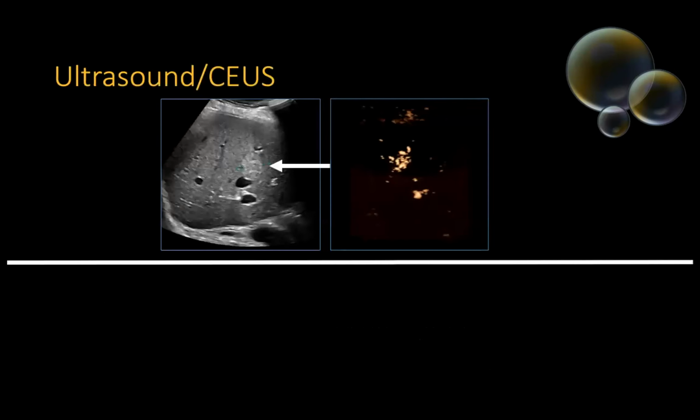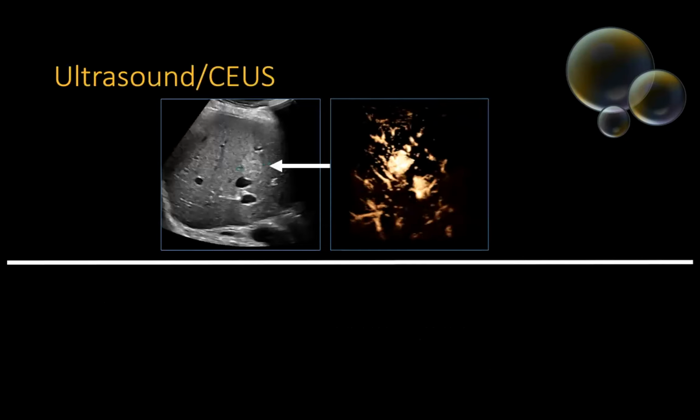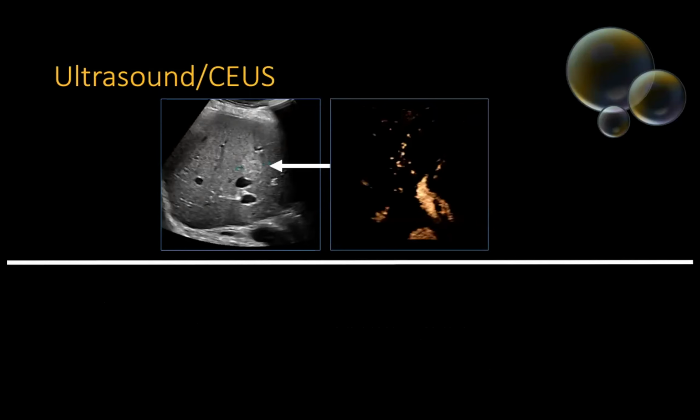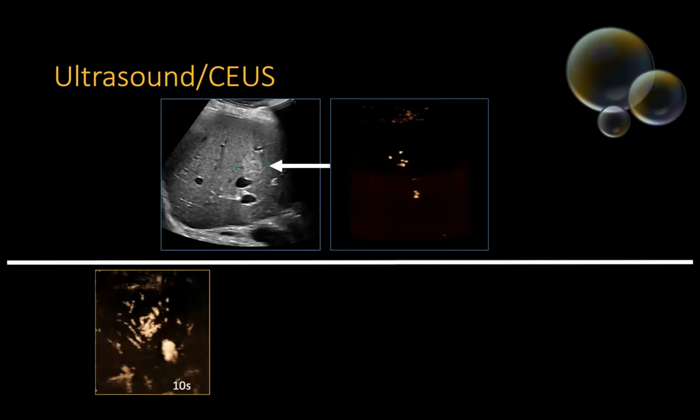So the patient comes for ultrasound, and we can see the arrow marking an echogenic nodule that corresponds with the nodule on the MR scan. And then on the right, we can see with bubble tracking technique that this lesion has centrifugal filling from the center to the periphery. It has a star-like appearance, and this, of course, doesn't suggest an adenoma.